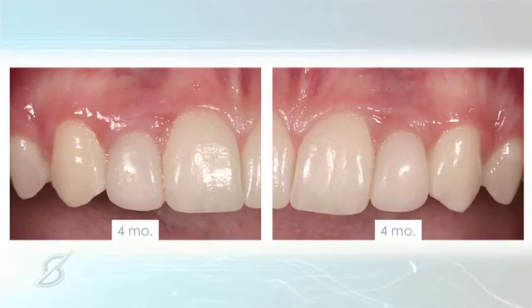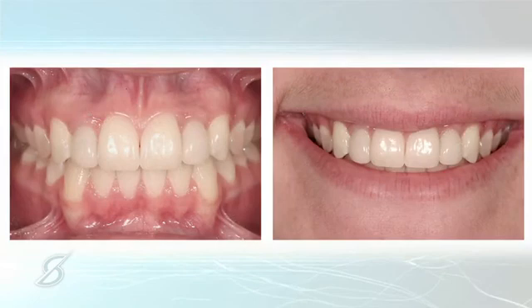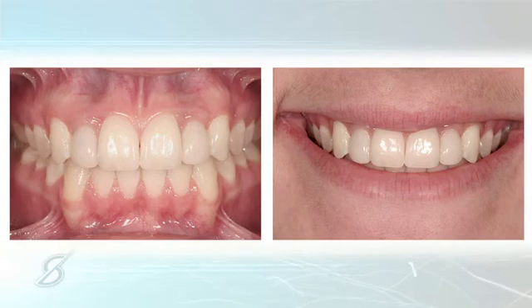And at 4 months, I would now choose to do my final impression, make my final crowns exactly like we did in the other patient. And here's what she actually looks like completed with the final restorations in place. And so just an illustration of how, again, we create the contour and then we just wait and let the body adapt to that contour.